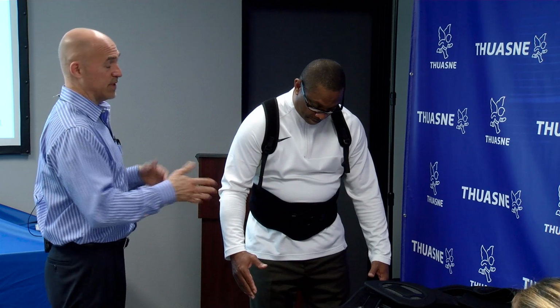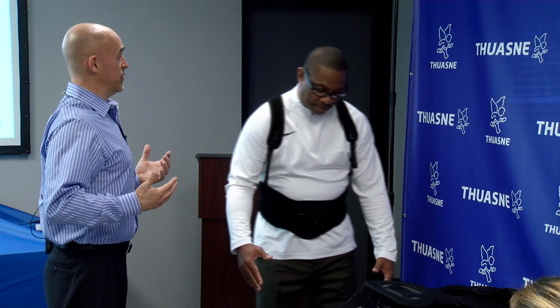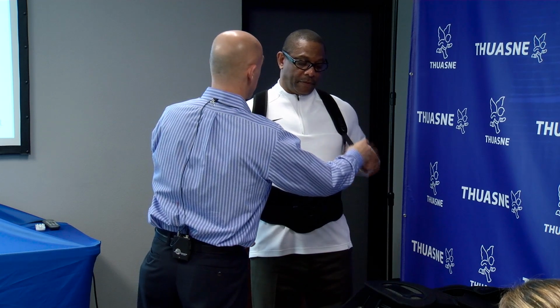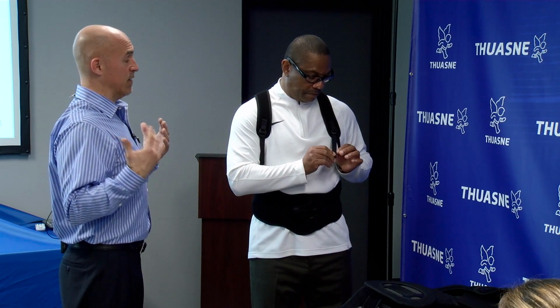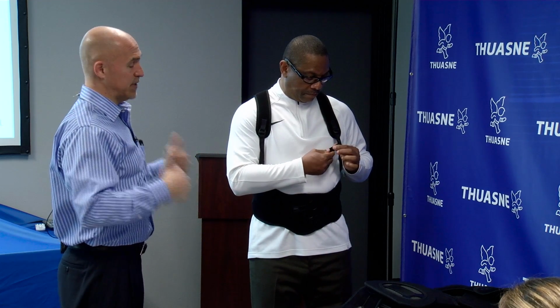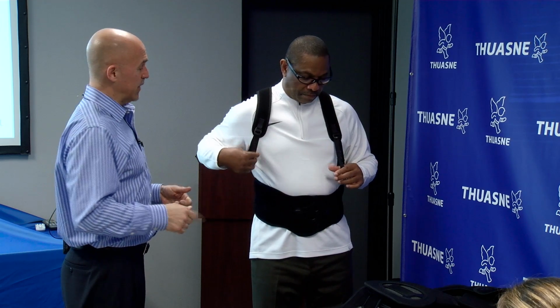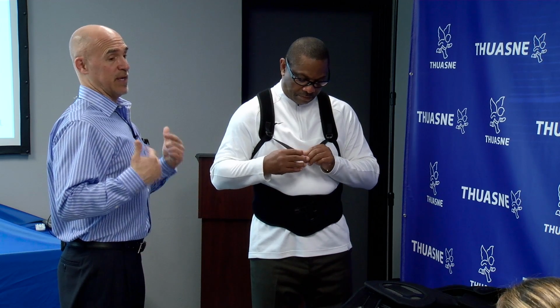So we're going to ask them to stand up as straight as you can, pull your shoulders back as far as you can go. Come on, work with me. I can go far. Yeah. So, all right, that's the key point. Before you tighten these straps, I want you to grab these with your thumbs. You've got to stand up as straight as you can, shoulders back as far as you can comfortably. And then you're going to pull those down, not too much, because if you pulled really hard, you'll pull the brace up. But it's critical that they stand up as straight as possible because we don't want the pressure on the top, we want it on the front.